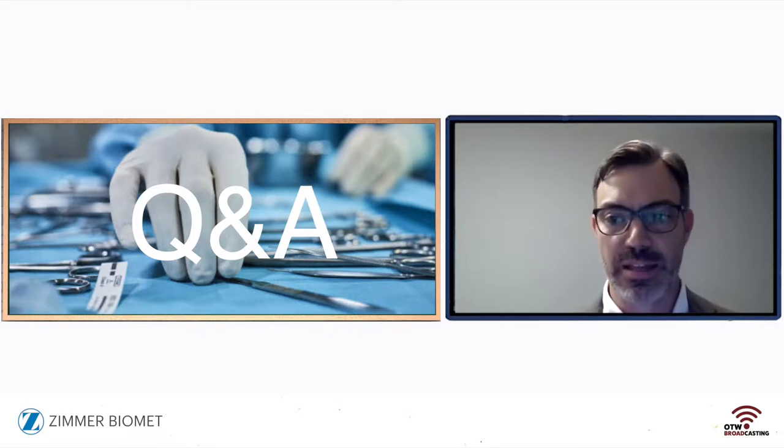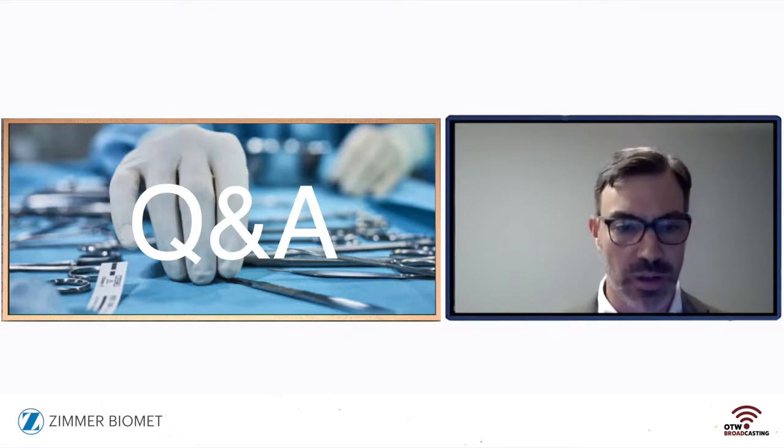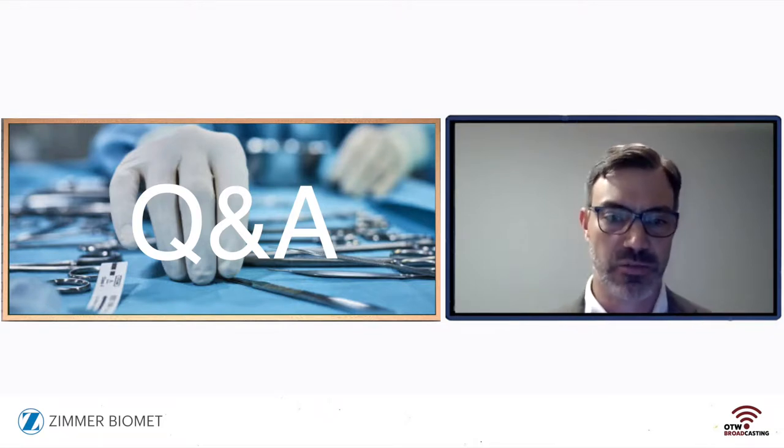And then obviously from a surgeon's perspective, if we can create a condition where the patient has one intervention and by the time they're done growing, they've got a condition that has a benign natural history, i.e. 35 degree curve or less, that they ought to do well. I think that's also successful.